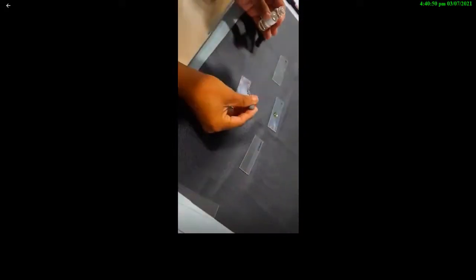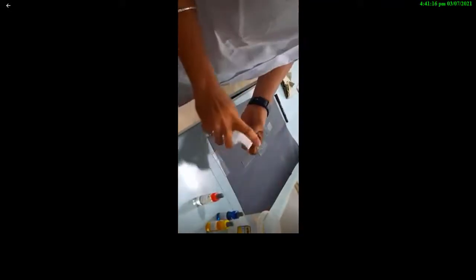On the control slide we will not add any anti-serum — only blood will be placed there. After that we have to prick our finger. We will take 70% ethanol and cotton, clean our finger, let it air dry, and then prick the finger.